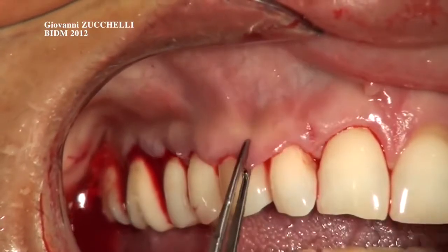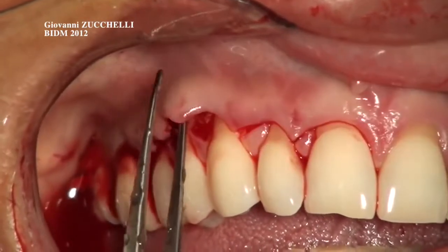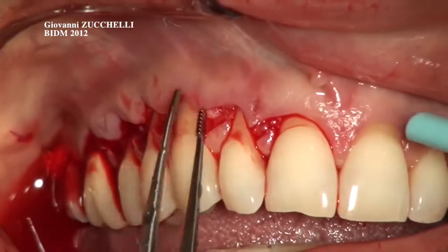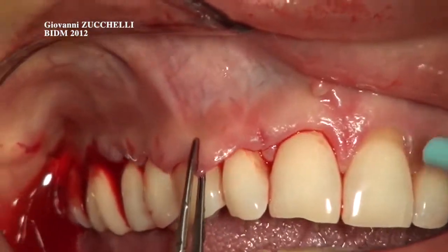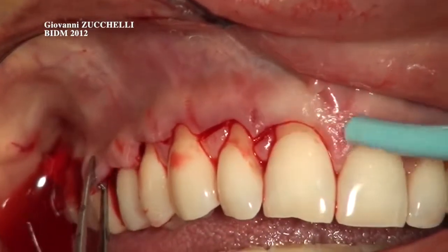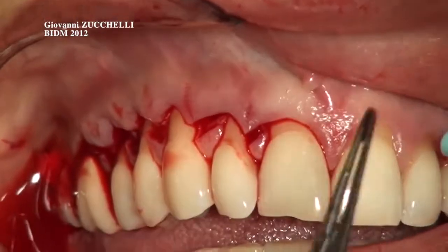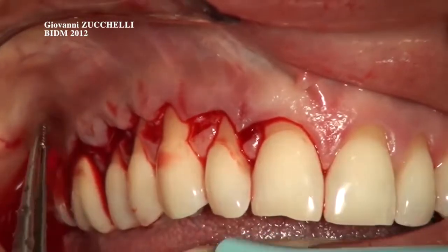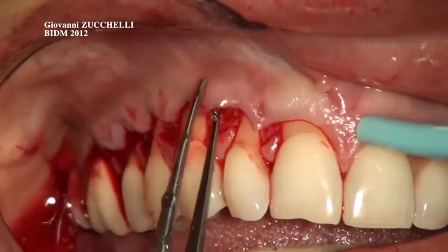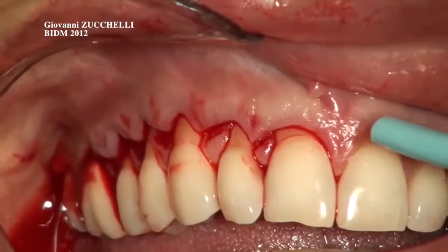The same is for the lateral, canine, premolar. Now the flap is really free, and when you see the flap, you don't see that there is any interruption in the alveolar mucosa, because even during anesthesia I didn't make any perforation with the needle in this area, because this lining mucosa is of crucial importance in the coronal advancement of our flap with no tension at all.